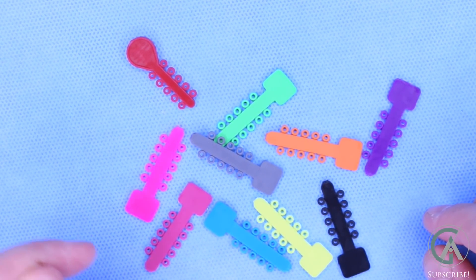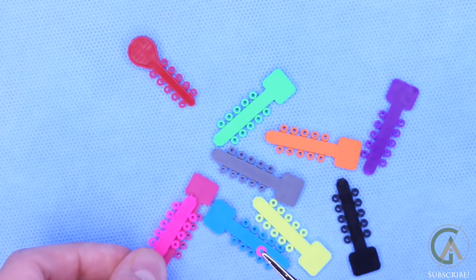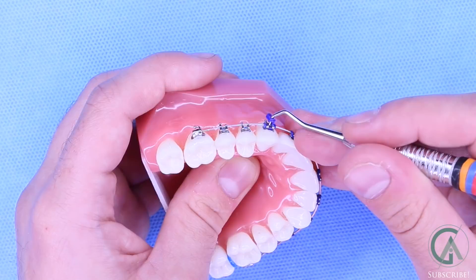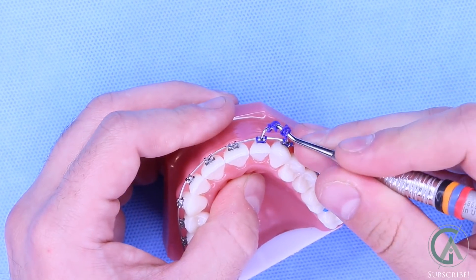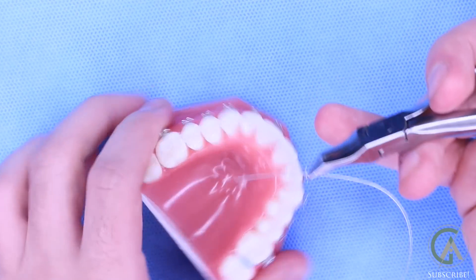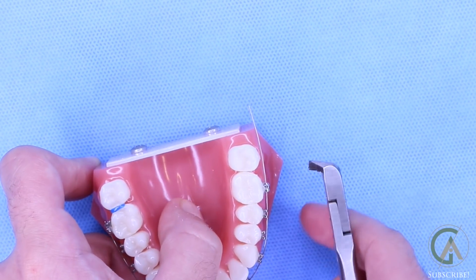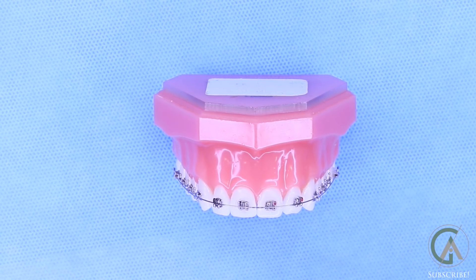You guys should be pretty familiar with what these are — these are some of the colors that the elastic O-rings come in. The way we apply them is that we just grab a hold of them and an individual one will be tied on each bracket. Here's an example of some model teeth where they have some colored O-rings on them. Let's take these off and put new ones on. You can see here that we're changing the wire, placing it into the braces and cutting off any extra wire so that it doesn't poke your cheek. Let's tie in this wire — let's go with my personal favorite, the teal.